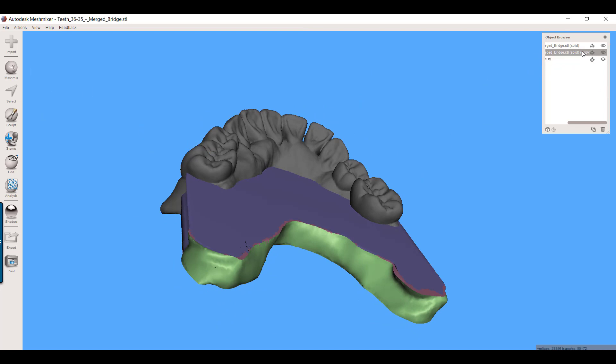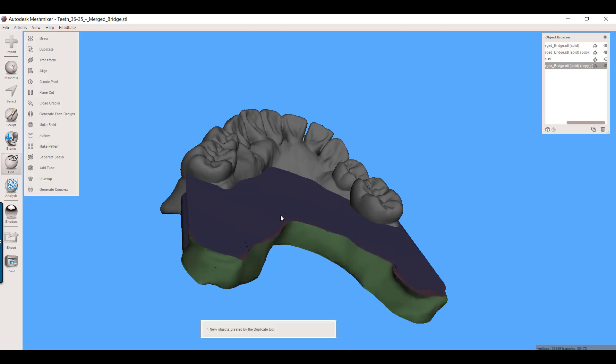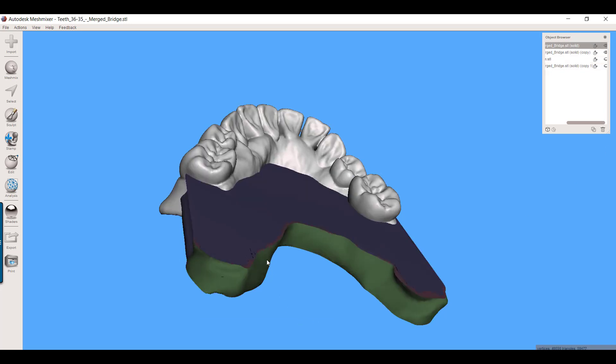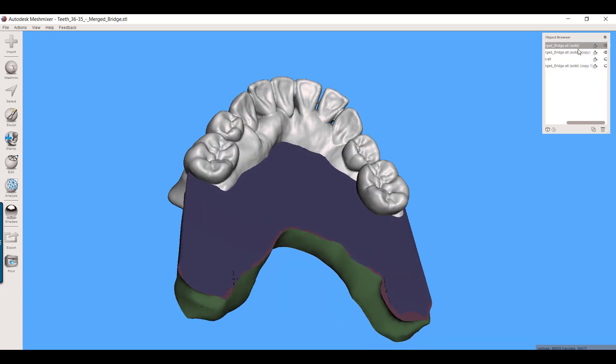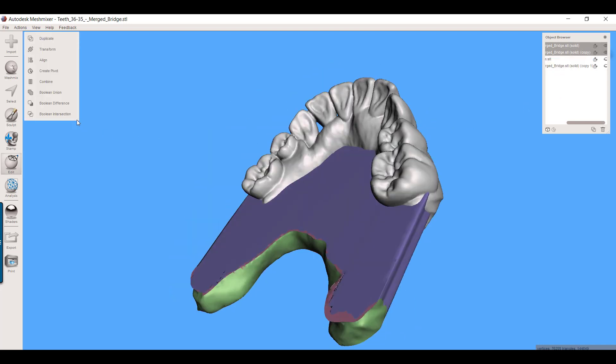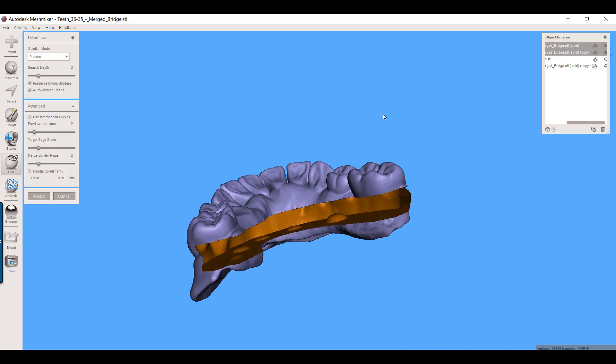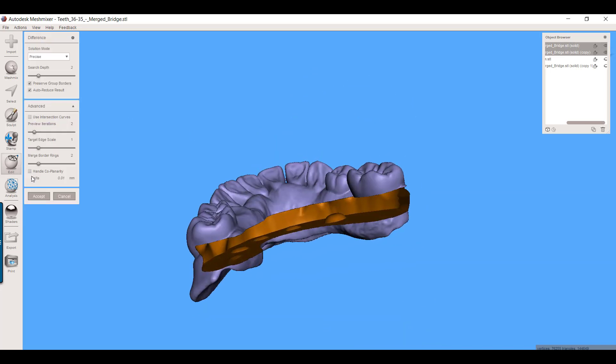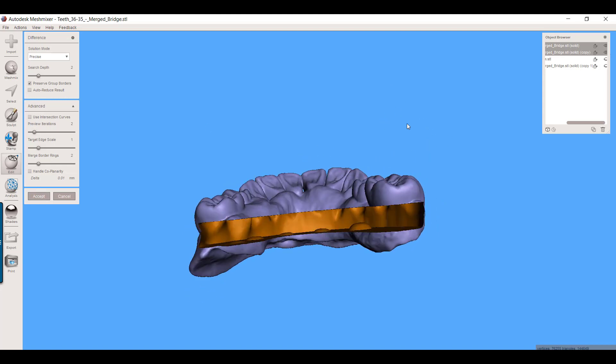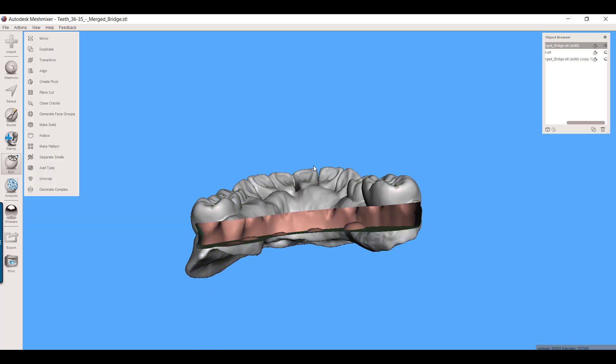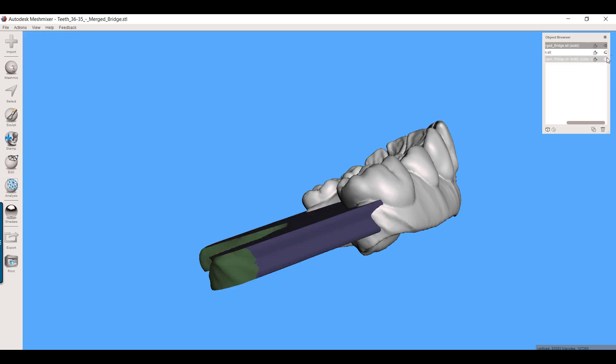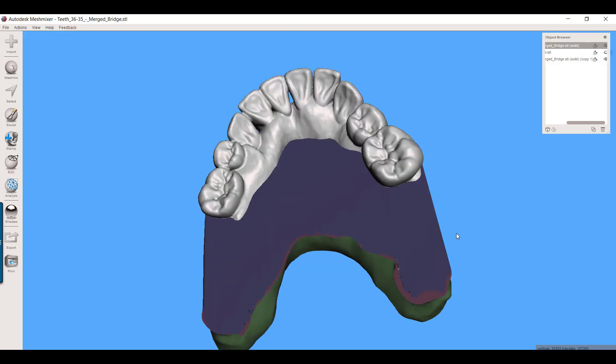Before you do this Boolean subtraction, I want you to duplicate this: edit, duplicate. So I've got two copies now of this. I'm going to just hide one of them. Now I've got these two objects. Select your bridge first from your objects browser. Now control-select the Trilor, and then just go over here to Boolean Difference. And there's your slot. I always uncheck auto-reduce results. Sometimes it can throw a little monkey wrench in things. Now I'll accept that. And here's our slot. Here is our template for the Trilor bridge.